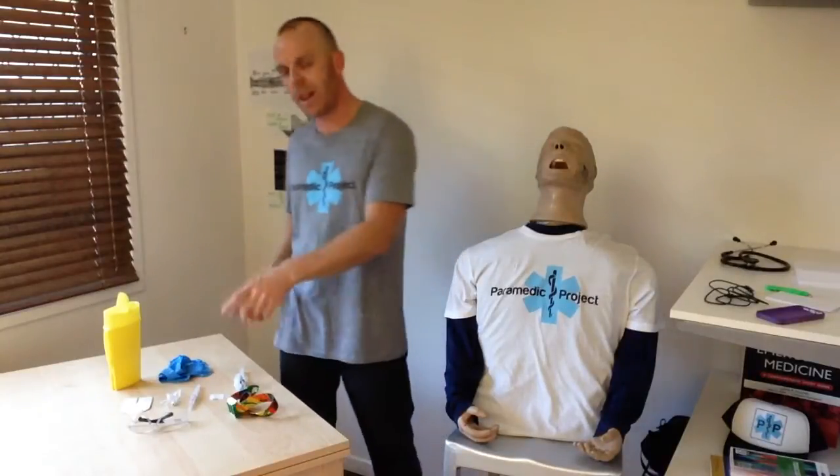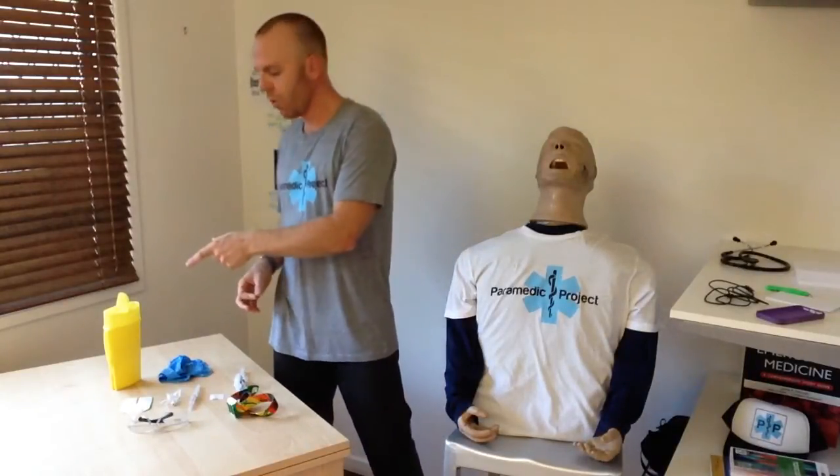To really shoot for that consistency, my biggest tip is that when we practice the skill, we practice the skill in its entirety. Putting the actual needle in someone's hand is about midway along in the skill. Before that comes equipment setup, and after that comes securing and flushing the cannula. You can't secure and flush the cannula well unless you have meticulously prepared your equipment — that includes your PPE, your glasses, your gloves, your sharps container.